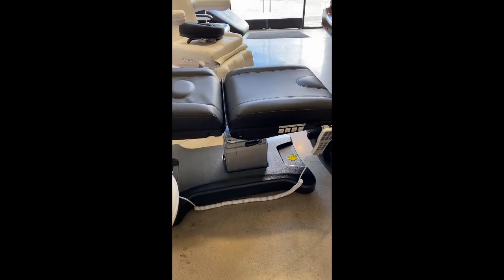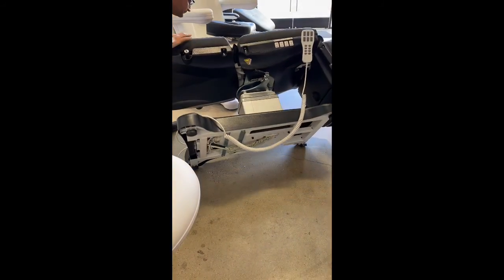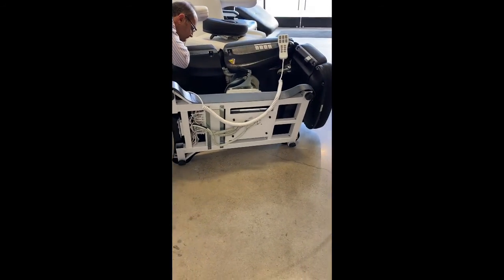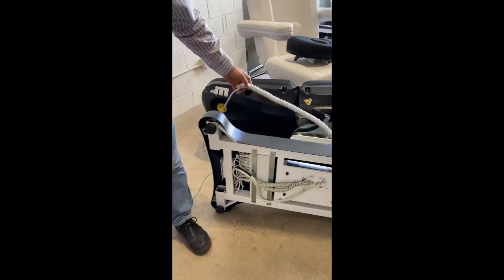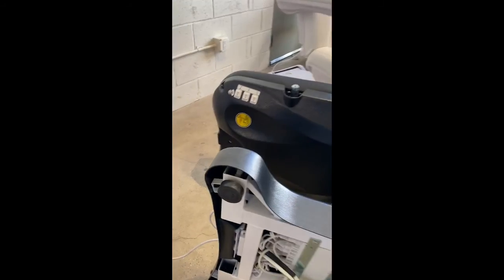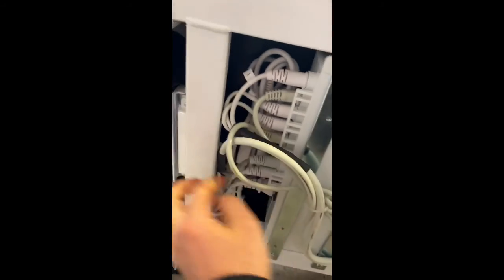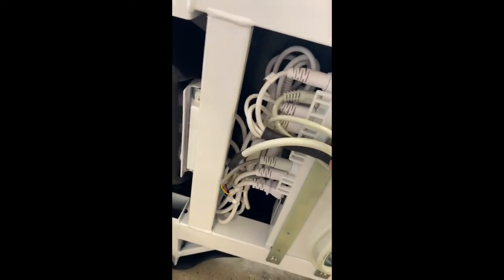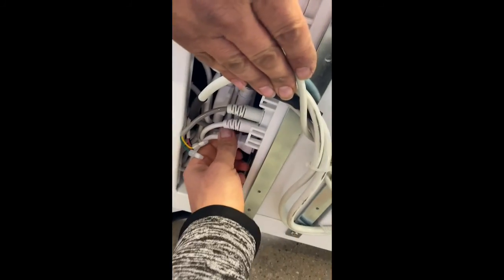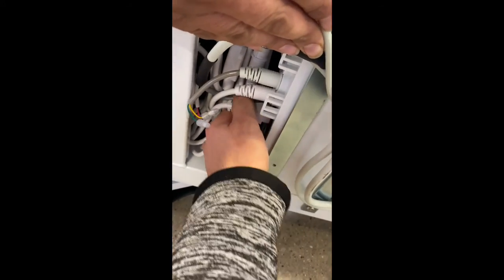Once it's flat, we're going to go ahead and put the bed sideways. And once the bed is put sideways, what we need to look for is the cable that is located right over here — this one here. This is the power cable.